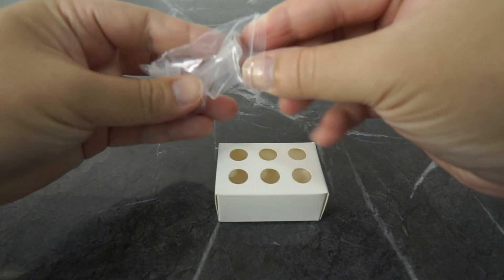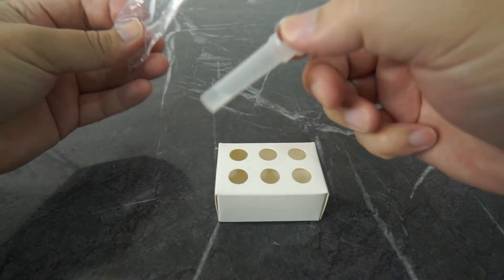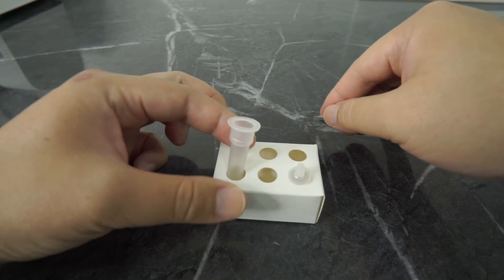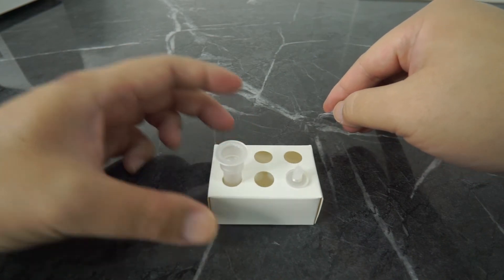Now let's start the test. First, open up the plastic bag, peel off the aluminum seal of the extraction buffer tube, and place it on the rack. Be careful not to pour out the liquid from the tube.